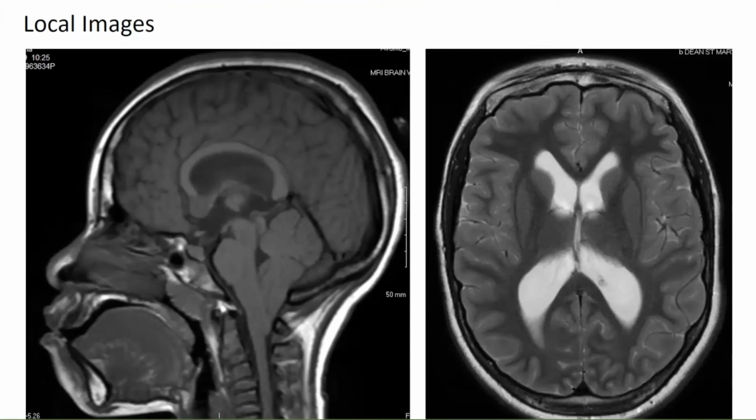As you know, a lot of these scans that are done locally in outreach clinics are not detailed scans. So this was sort of, I would call, a preliminary scan. But you're absolutely right. This is a red flag. She has ventricles that are certainly larger than usual, and you correctly pointed out the tonsillar ectopia.